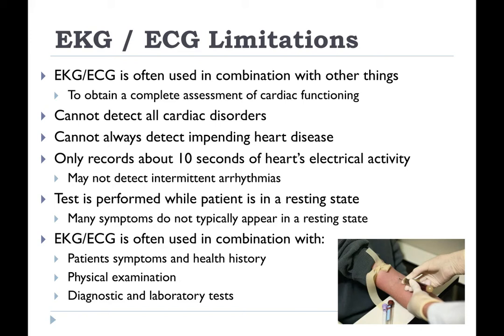The test is performed while patient is in a resting state, and a lot of times symptoms do not appear at a resting state. And it's usually used in combination with the patient's symptoms and health history, physical exam, and additional diagnostic and laboratory tests.